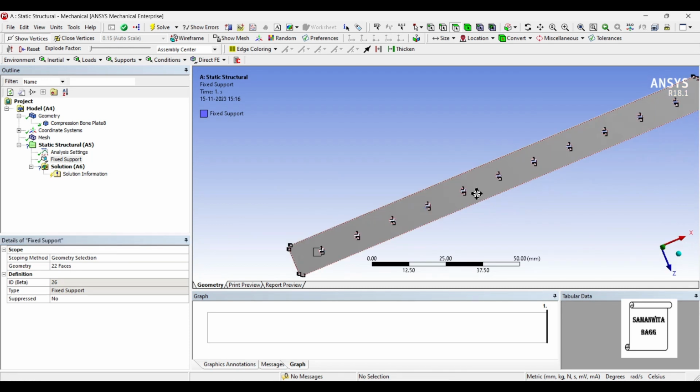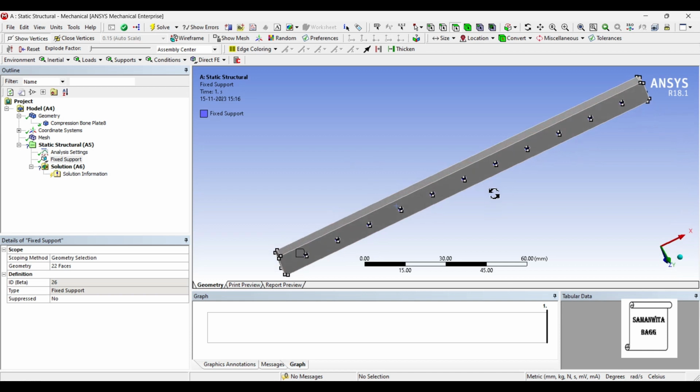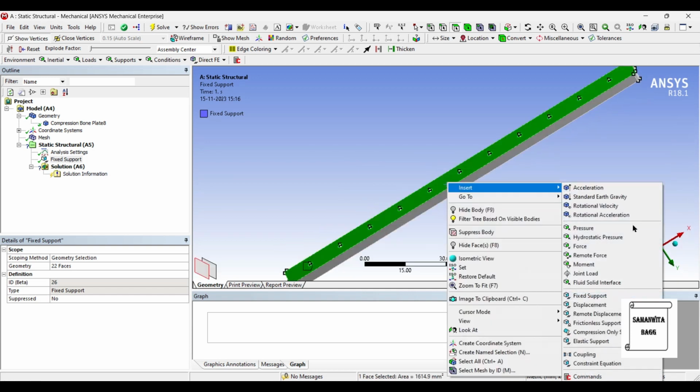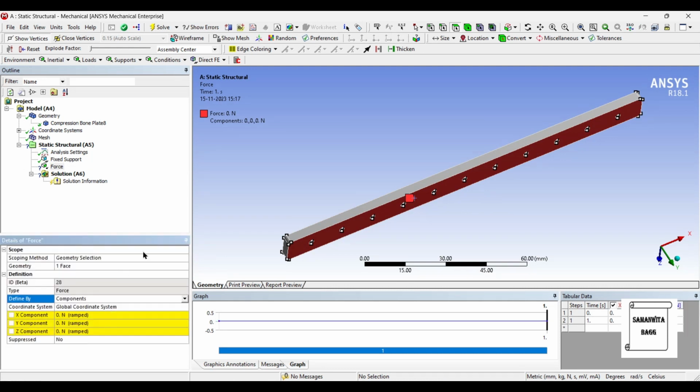And apply. As you are aware of the function of the compression bone plate, if this is the side where the bone is going to lie and this is the plate fixed on it, the screws will be attached on the other end. So I am going to apply force on this face where the compression is going to be exerted. This is the side where the bone is. So I am going to apply in the component form. Along the y-axis, I am going to apply a load.